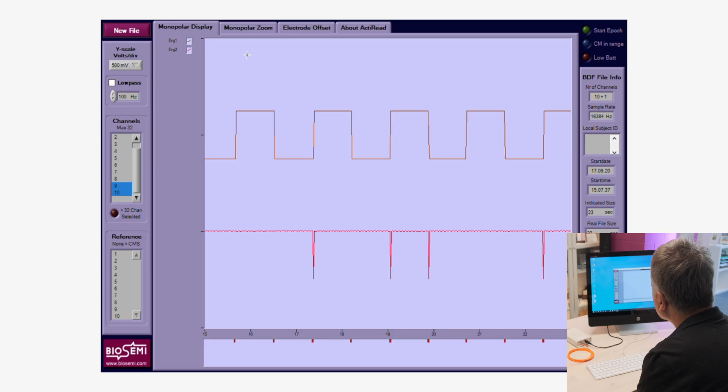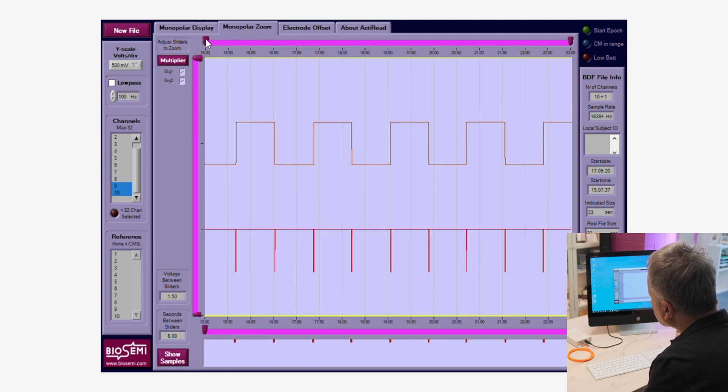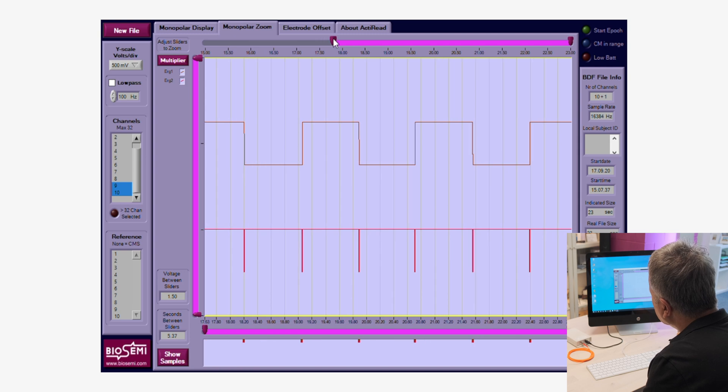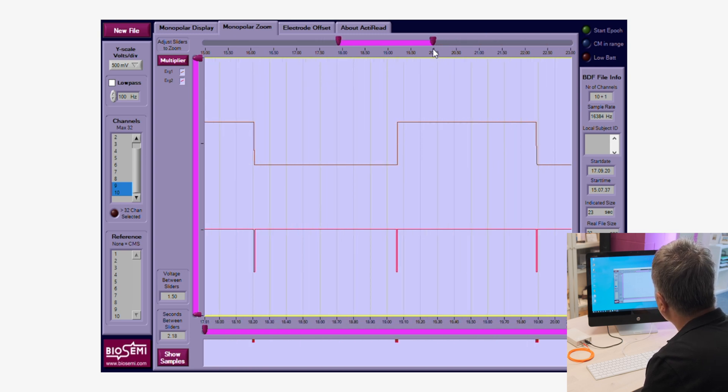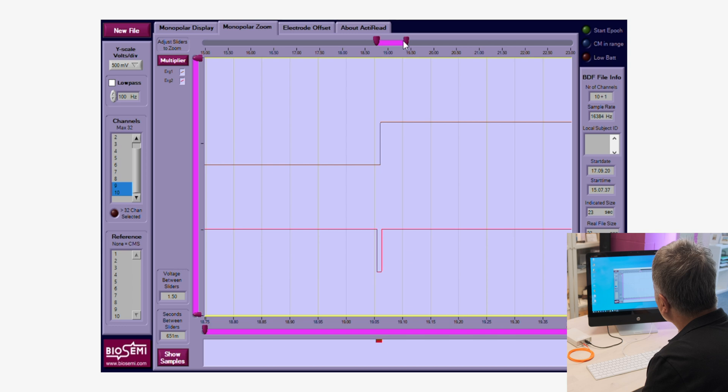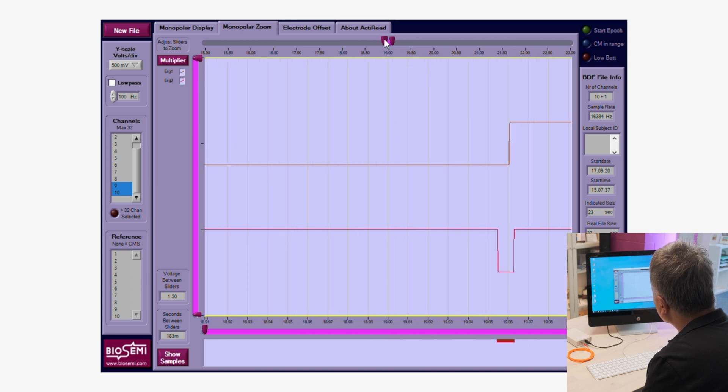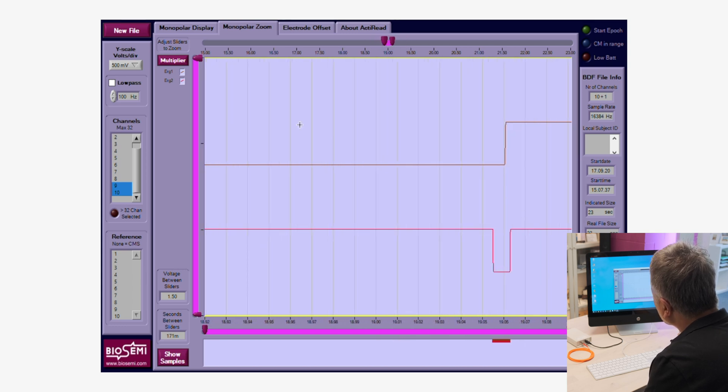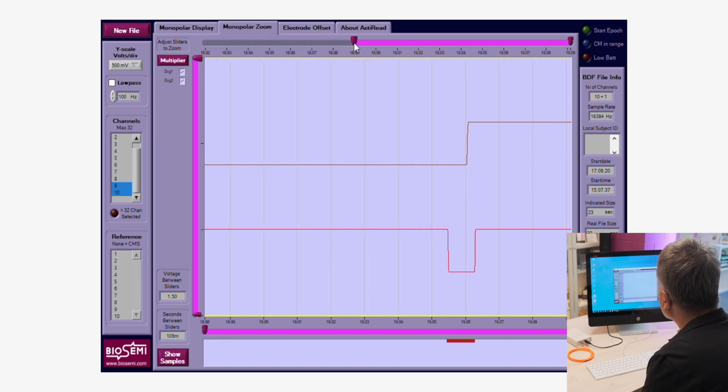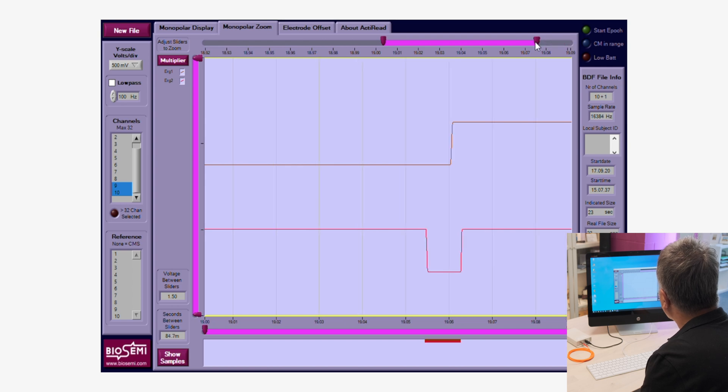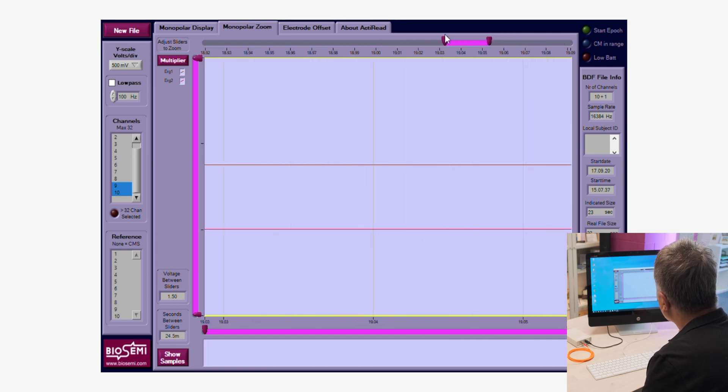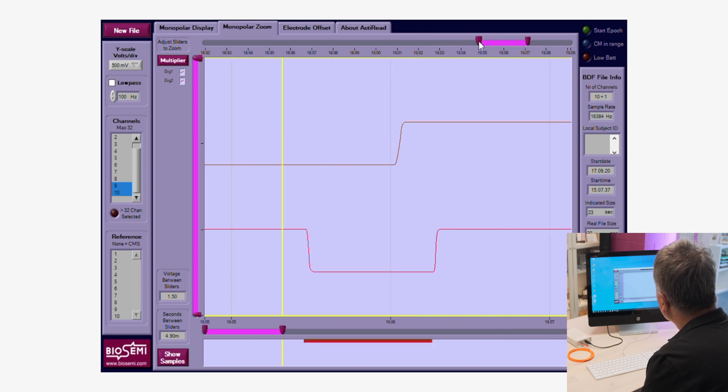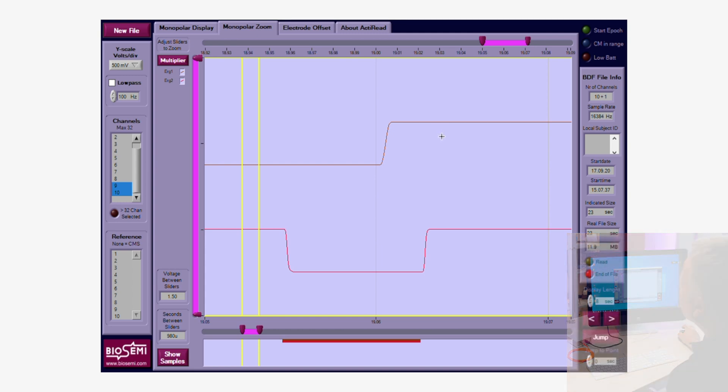So first we go to monopolar zoom. And then we can see up here we can see sliders. These sliders let us focus in on a section of the recording. Now we can see as we close these two levers, it's still not good enough so we can actually apply the multiplier which is really cute. So we just pull and pull until we get the data nicely on the screen. We need to play a bit with this. This is not so easy. Now we have it really nicely on the screen.